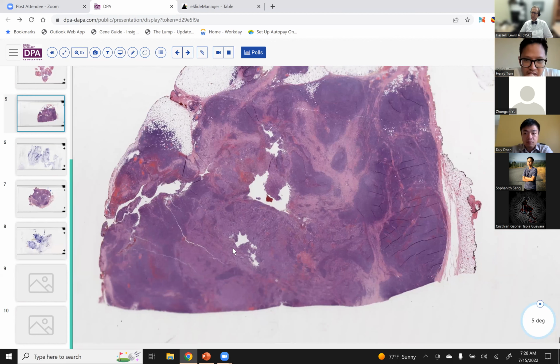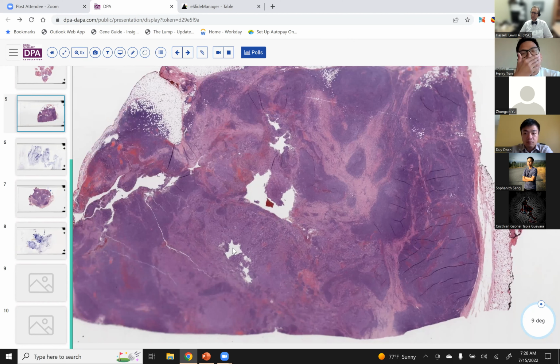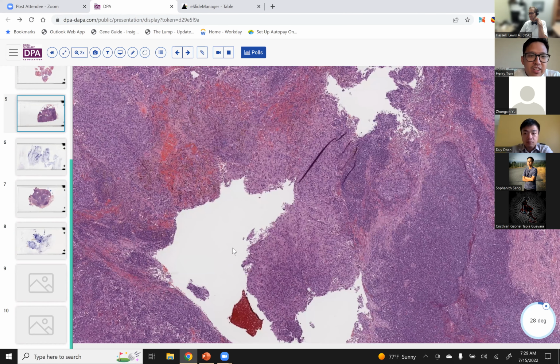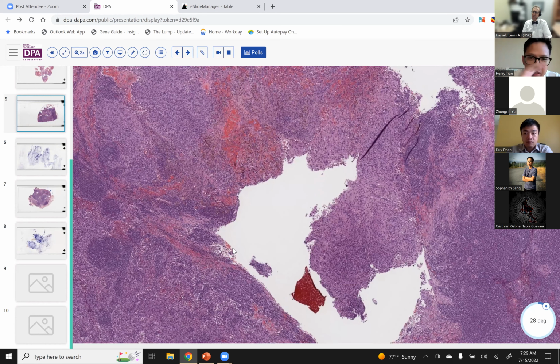So the most striking thing about this is we have this lymphoid cuff around the tumor. So you have to know that one tumor that tends to do this is a lesion called angiomatoid fibrous histiocytoma. And it gets its name because it has a lot of these cystic spaces that look hemorrhagic. Hence the word angiomatoid, the suffix -oid, like a vascular space.